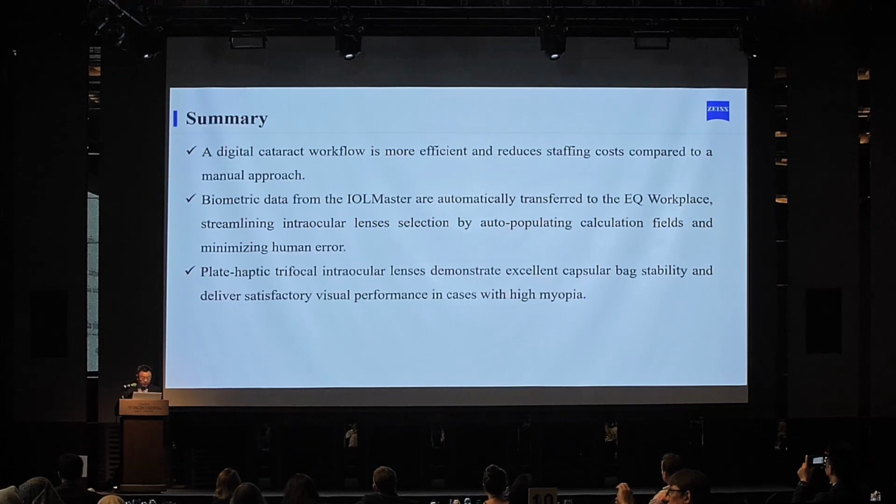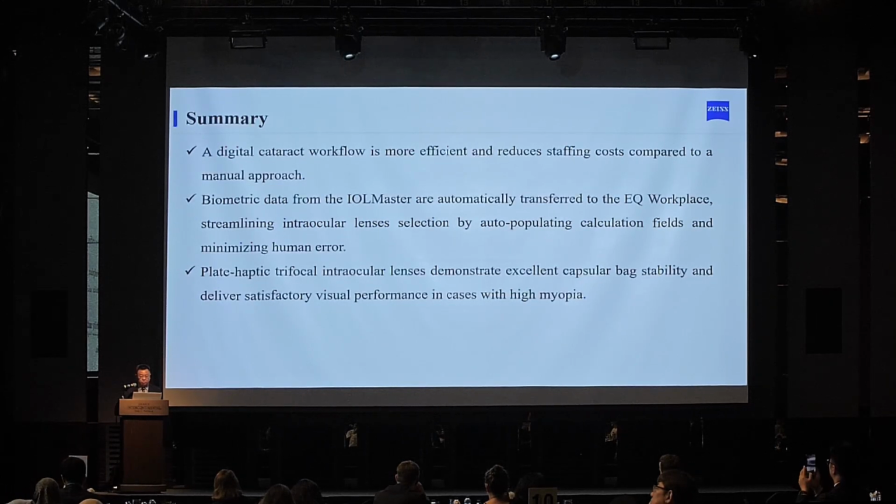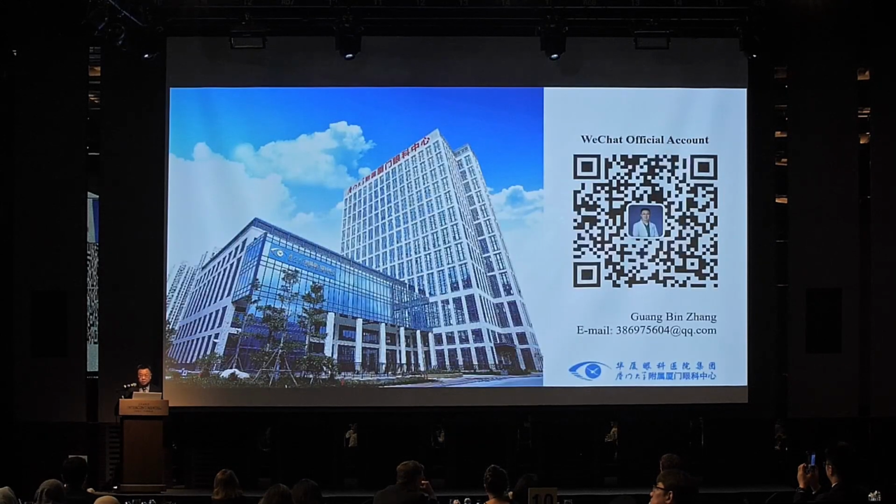In conclusion, a digital cataract workflow is more efficient and reduces staffing costs compared to a manual approach. The biometric data from the IOLMaster are automatically transferred to the EQ workplace, streamlining intraocular lens selection by auto-populating calculation fields and minimizing human error. Plate haptic trifocal intraocular lenses demonstrate excellent capsule bag stability and deliver satisfactory visual performance in cases with high myopia. Thank you for your attention.